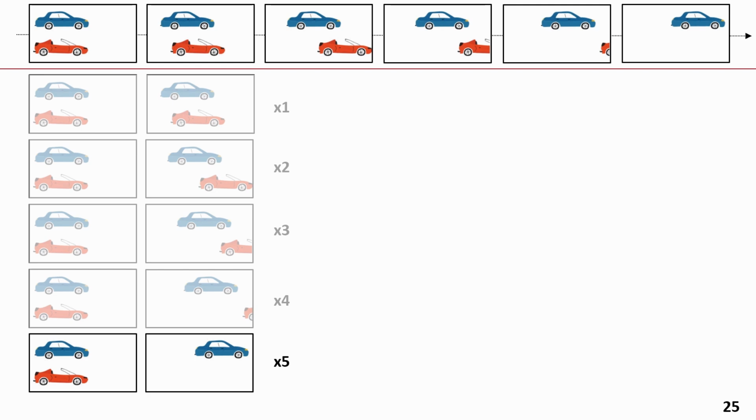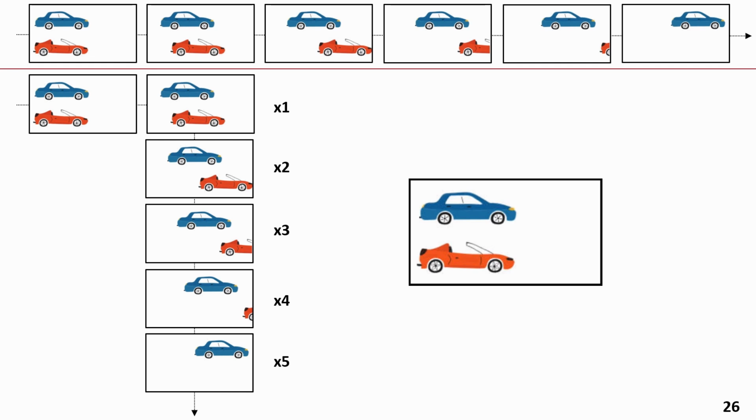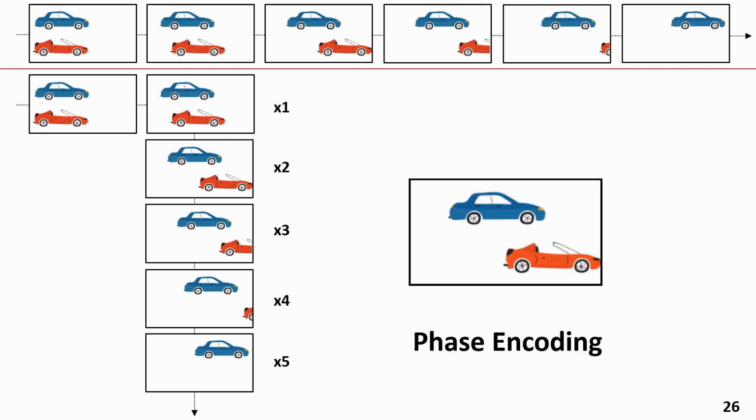as well. If we look carefully, the single photographs that we shot during each experiment contain the same information as the ones that we have for reference at the top above the horizontal line. So we can stitch them together and have a video of the racing cars where we can estimate their speeds. This complicated way to create our video is how phase encoding works in terms of capturing the data we need.